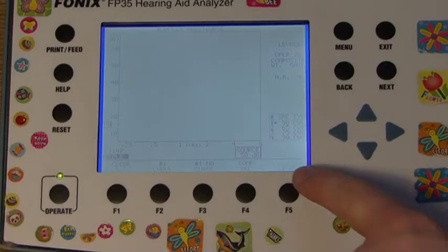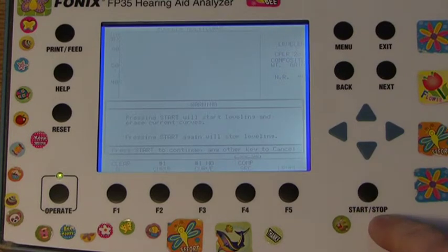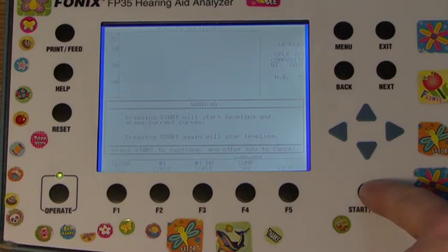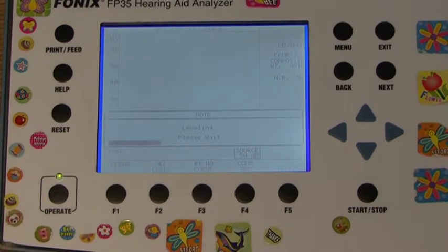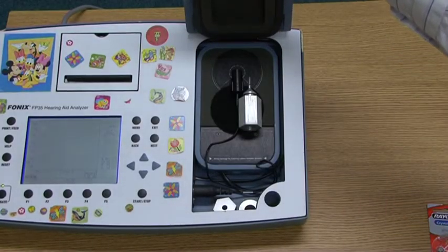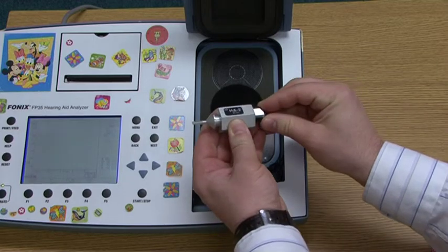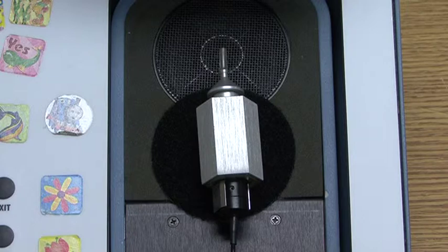Above F5 should read Level. Press the F5 button. A warning will appear on the screen that pressing Start will start leveling and erase current curves. Press the Start button. A leveling tone will be generated inside the test chamber and a status bar will run across the screen for a few seconds. The device will display Leveled in the top right corner of the screen. Open the lid and connect the reference microphone to the HA2 coupler, pushing in fully. You are now ready to proceed creating comparative gain curves.